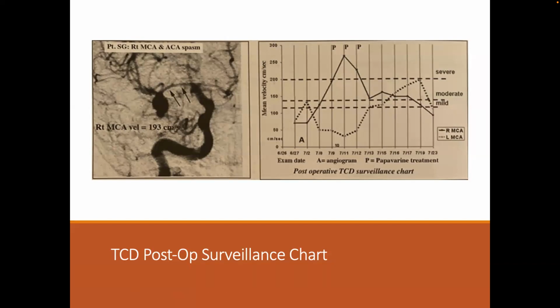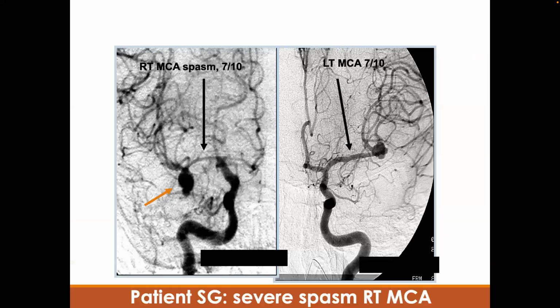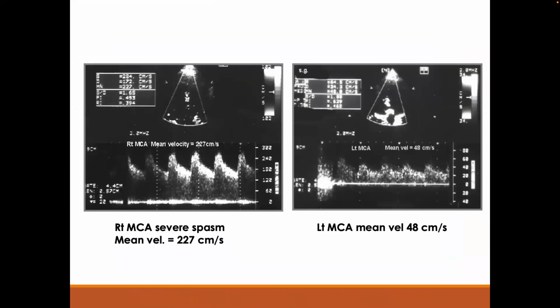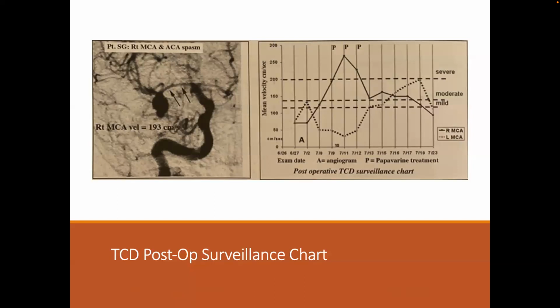So there's a graph on the bottom here. 7, 10, 11, and 12. What's that? To the left of the arrow, is that large... I think that's an aneurysm. Yeah. So they didn't explicitly say it, but I'm guessing that's what that is.